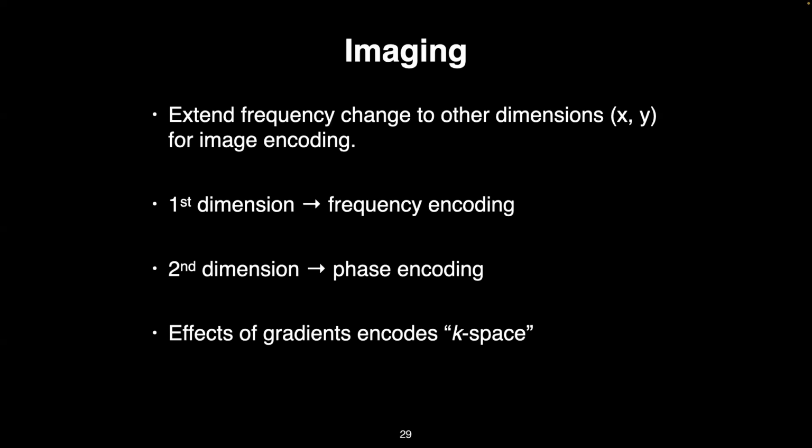So any questions? I know that's quite a bit to unpack or think about. So in essence, we're using our gradients to change how the protons behave spatially and how they transmit RF. And for the RF we're detecting, we're using that known variation, the spatial distribution of the gradients, to do the Fourier inverse on our signal and get back an image.